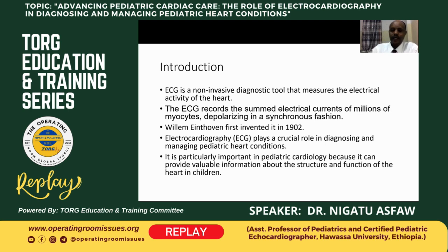It can help us understand the structure as well as function of the heart. If there is an abnormality in ECG, that may show structural or functional abnormality in the heart or other pathologic conditions, which need further investigations to reach a conclusive diagnosis.